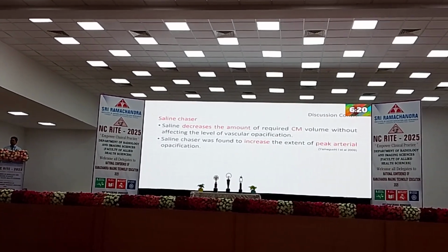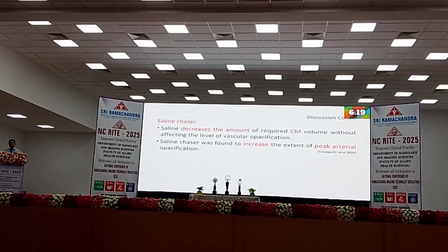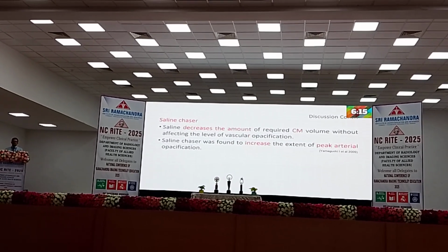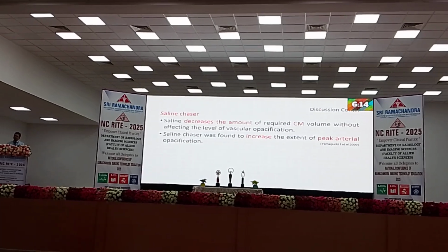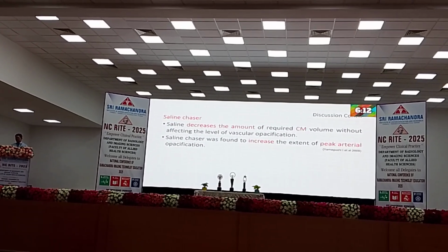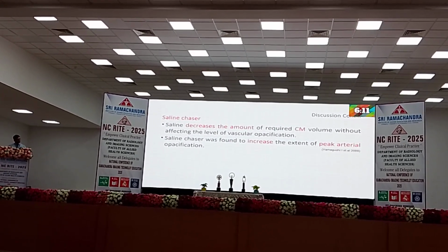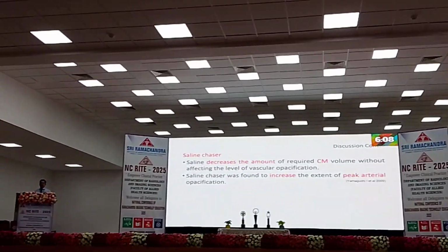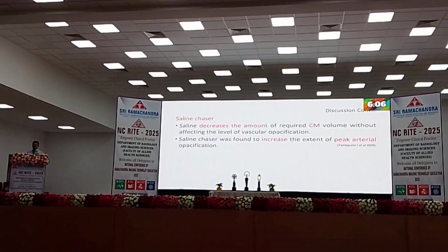So saline chaser, it is very important. Whenever I go to most of the examination sessions, I ask what is the reason for using a saline chaser. Most of them are not able to answer. The first reason: you are able to reduce the total amount of contrast given to the patient.